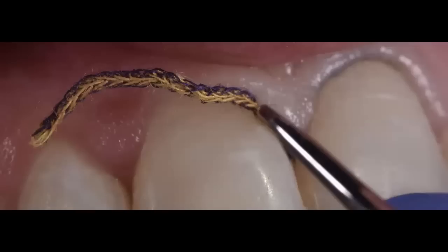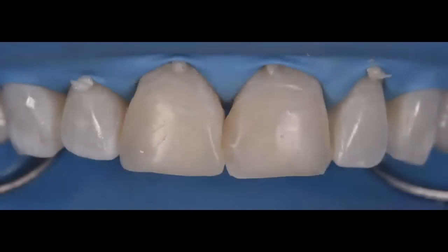But number 2, and most importantly, you're creating some space so that you can then go about inverting your rubber dam. And when I'm doing this type of restoration, I not only invert my rubber dam by using forced air and pushing the rubber dam subgingivally, but I help myself push the rubber dam more apically by means of a floss ligature technique, which I always recommend when you're working on anterior teeth and where you're going to do direct restorative work.